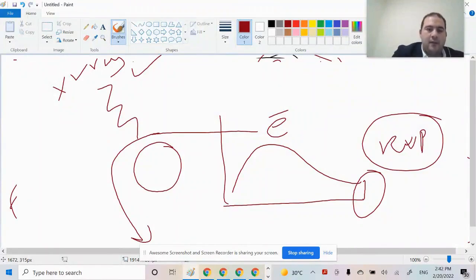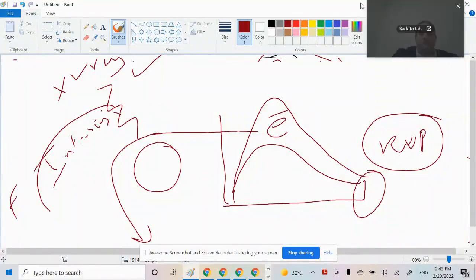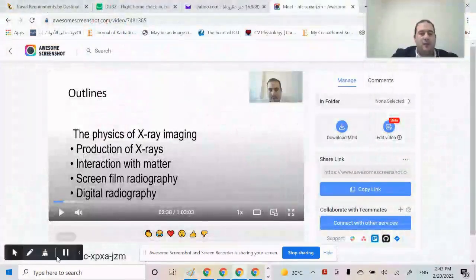If they increase, the atomic number of the material increases with the increase in the thickness, which increases the intensity or quantity of the X-ray photons that will be produced. You will find that your spectrum enlarges as a result of the increase in your atomic number, which increases the probability of interactions. In this case, you have a thicker spectrum or a higher intensity of X-ray.